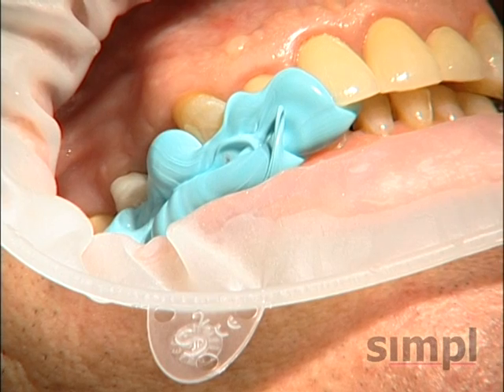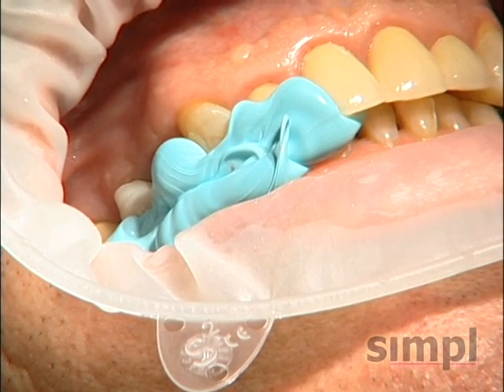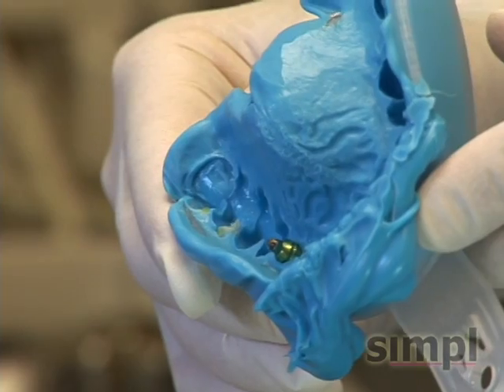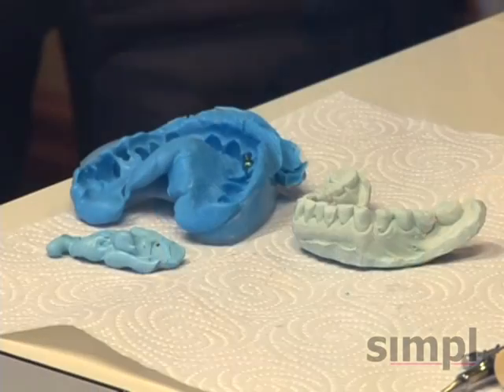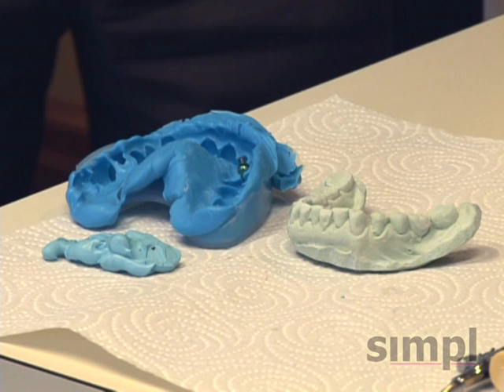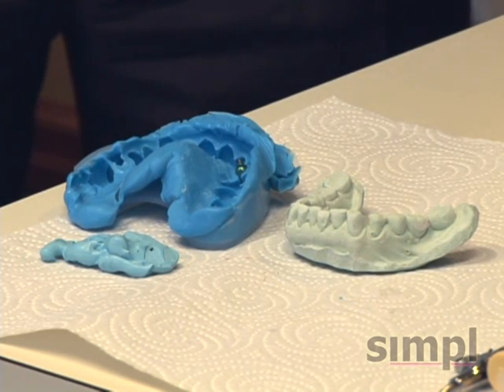You can take your shade. Take a shade with it on, actually. Okay, what else? That's it. Nice and simple. Okay, so, and then we have the bite. We have the impression. Counter. Simple.